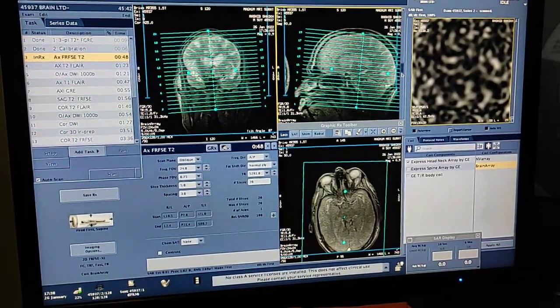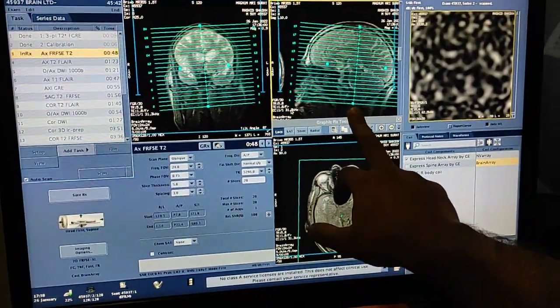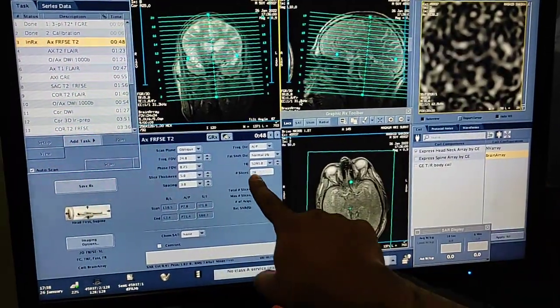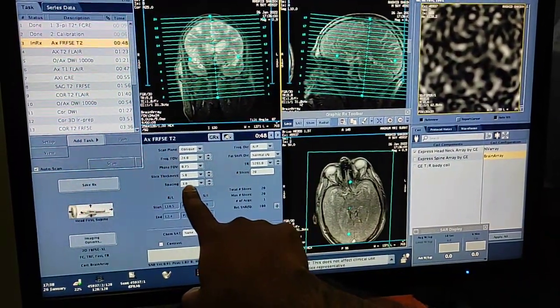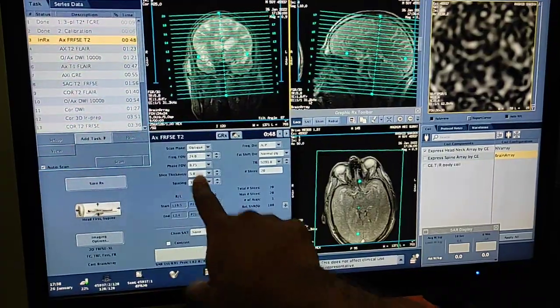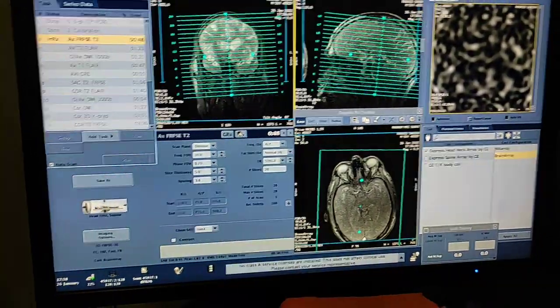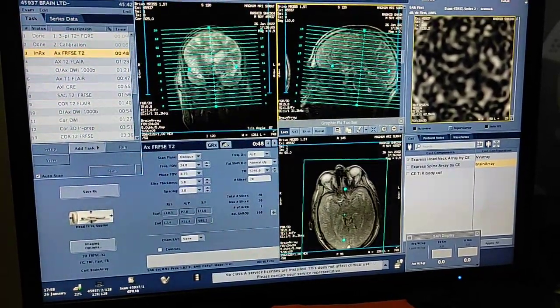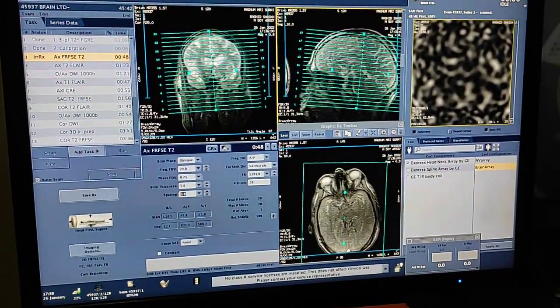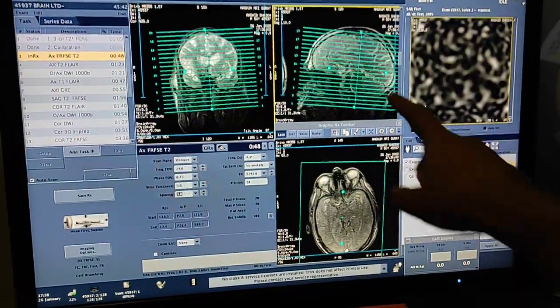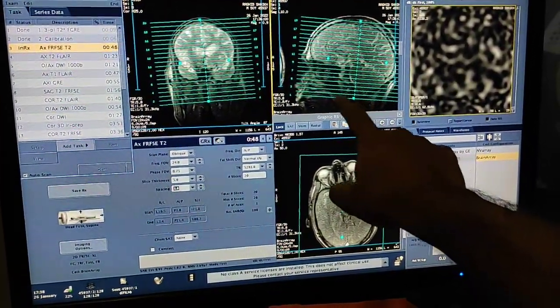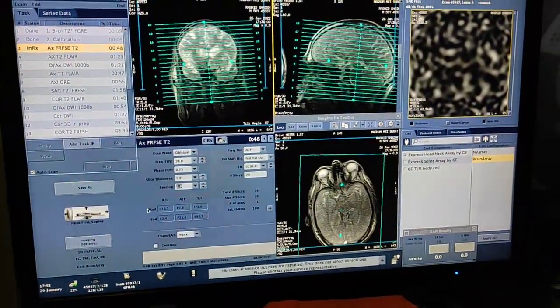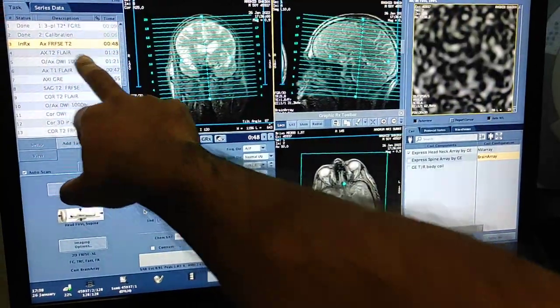For planning the brain, you have to look at the sagittal images. Coverage is from base of the skull to vertex — 20 slices, spacing 3 mm, slice thickness 5 mm. You have to set the spacing according to the patient's skull. A spacing of 3 will cover the whole brain, from base of skull or CVJ to vertex.